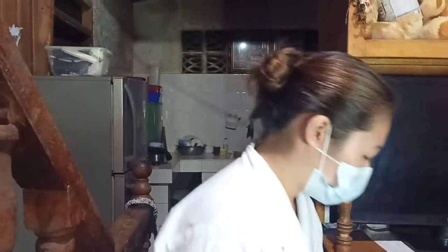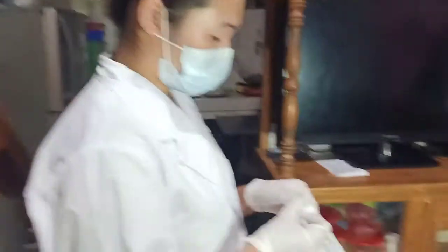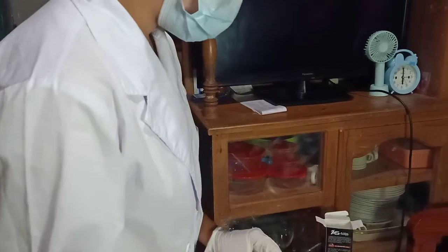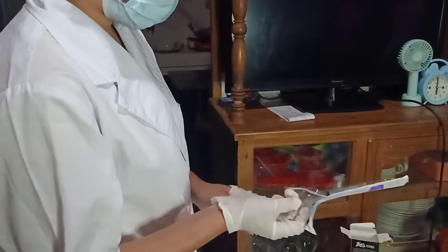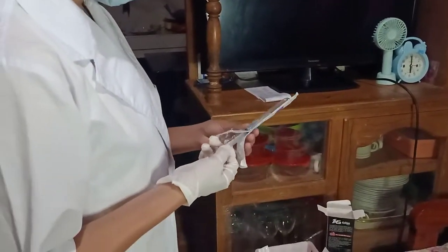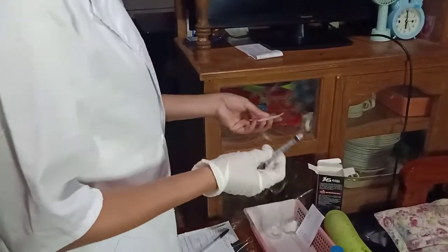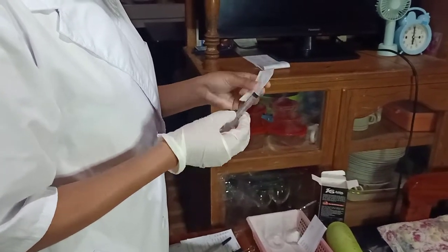And next, we have to separate and connect the aspirating needle.